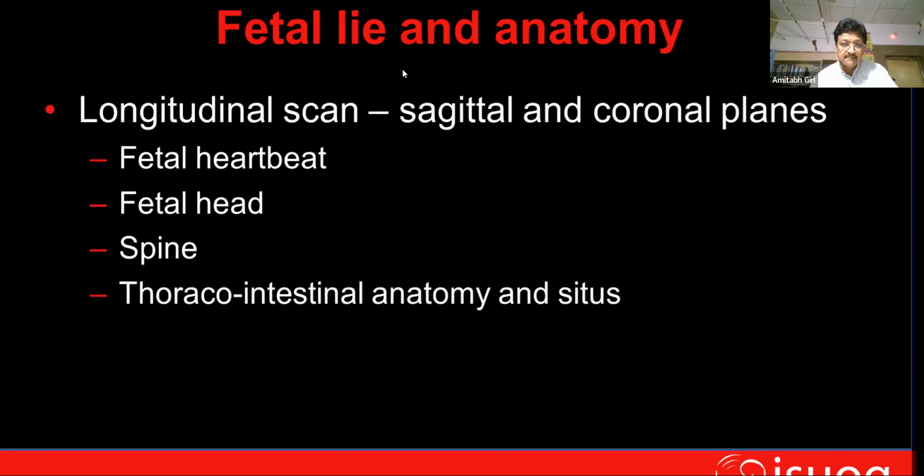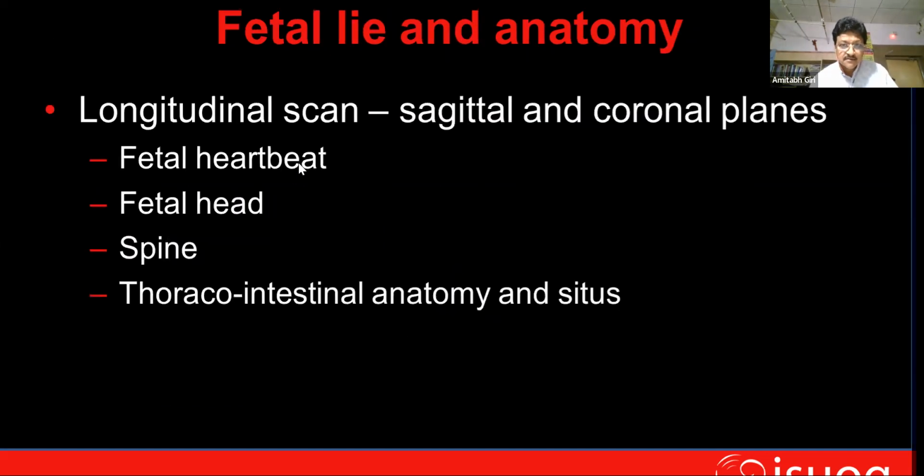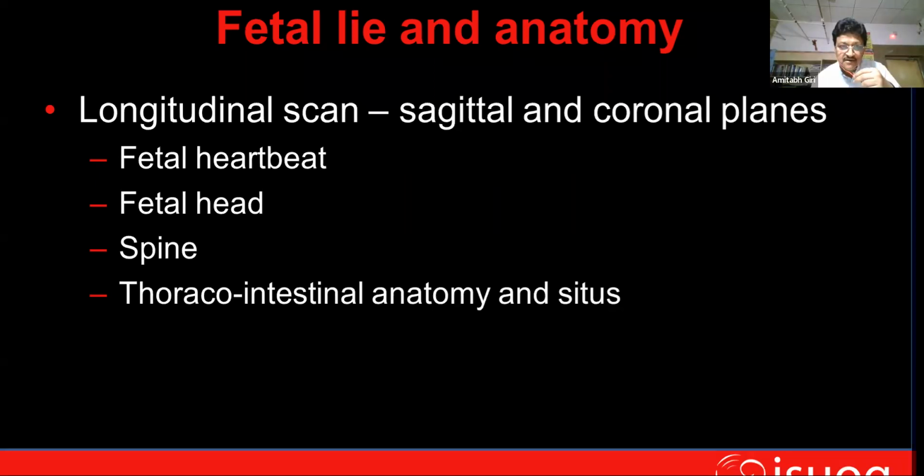So fetal lie and anatomy. The longitudinal section is basically the sagittal and coronal planes.